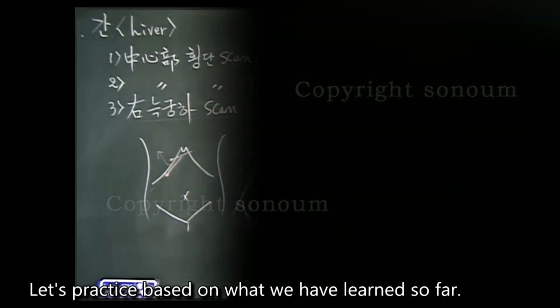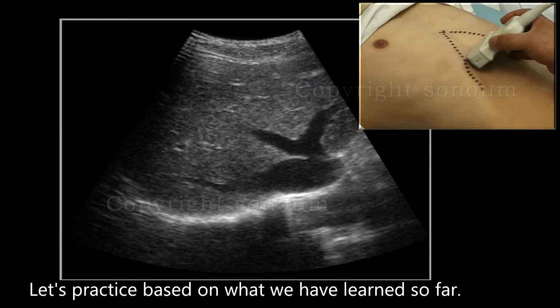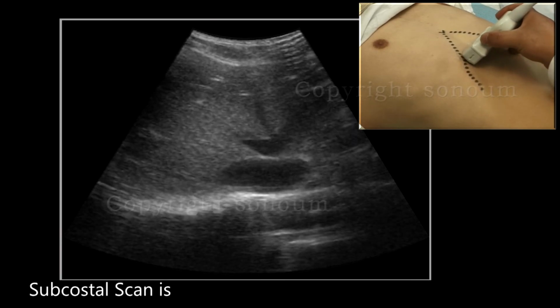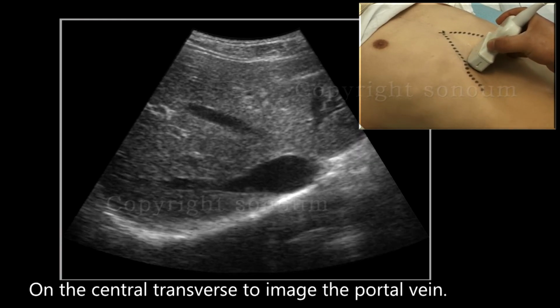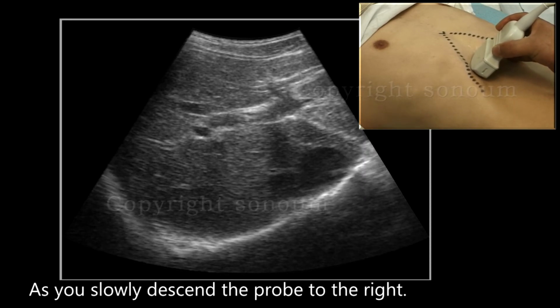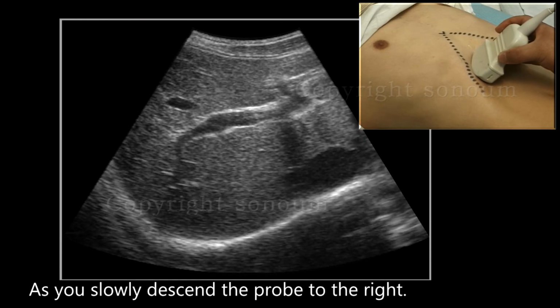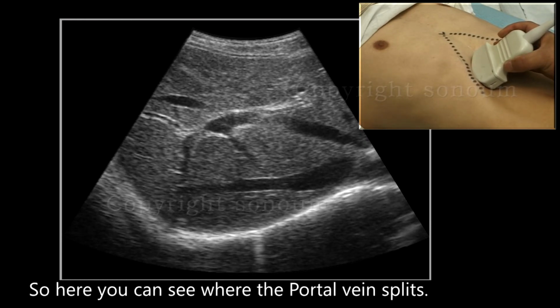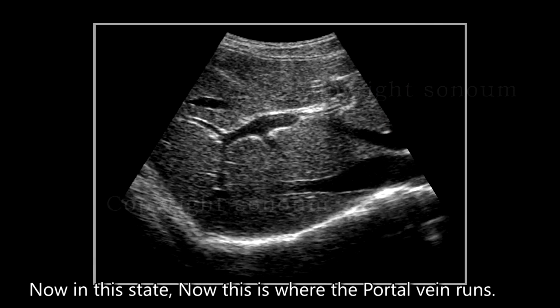Let's practice based on what we have learned so far. This is a subcostal scan practice. The subcostal scan is done on the central transverse to image the portal vein, digging under the right rib. As you slowly descend the probe to the right, here you can see where the portal vein splits. Now in this state, this is where the portal vein runs.